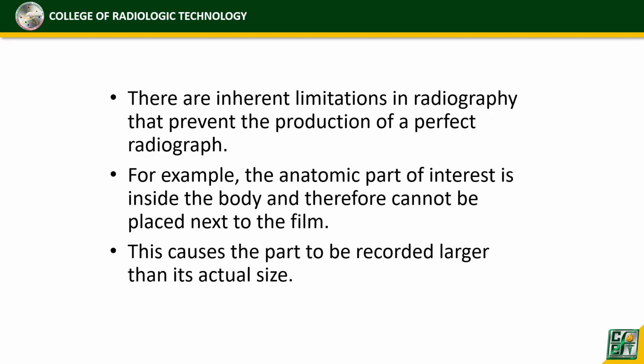Remember that general principle, kapag tayo ay nag-X-ray, di ba, the part to be examined should be placed closest to the image receptor. So, ang ibig lang sabihin nitong statement na to, yung anatomical part of interest inside the body, inherent siya.